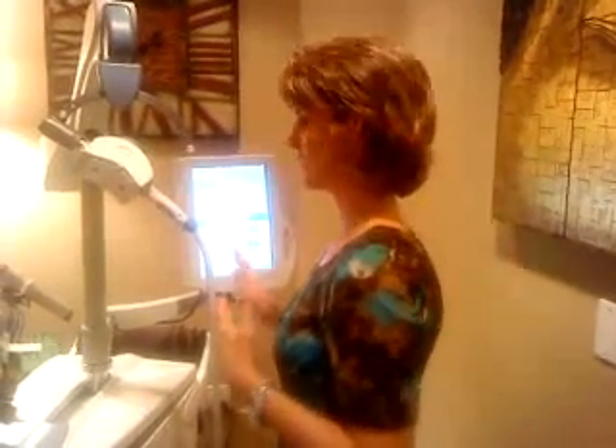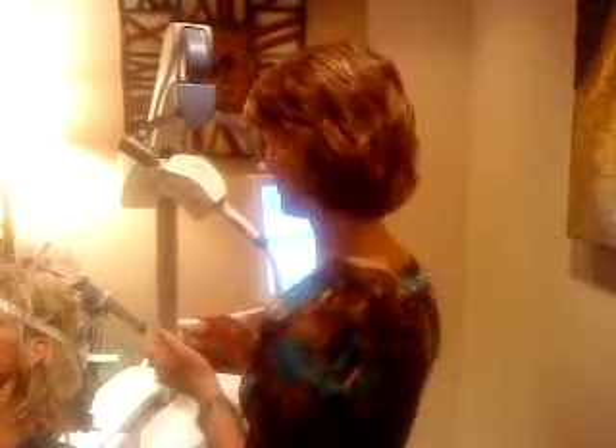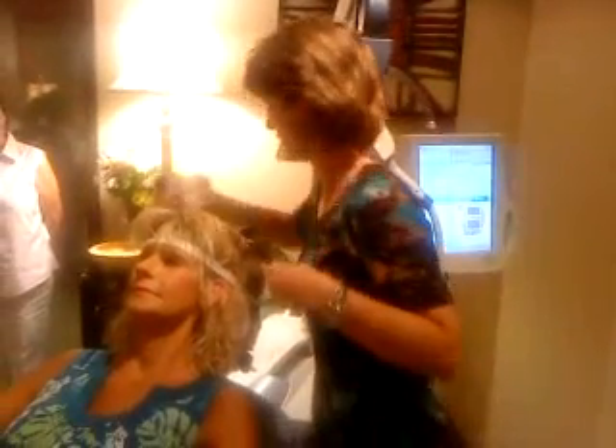A train is four seconds on. If someone moves and misses a particular four seconds of treatment, it'll tell us at the end that we missed a train, and it'll pick it up at the end. That's where this is so user-friendly — they want to get each treatment for good reason. We've got all the measurements in, and we use the straps to keep it in position.